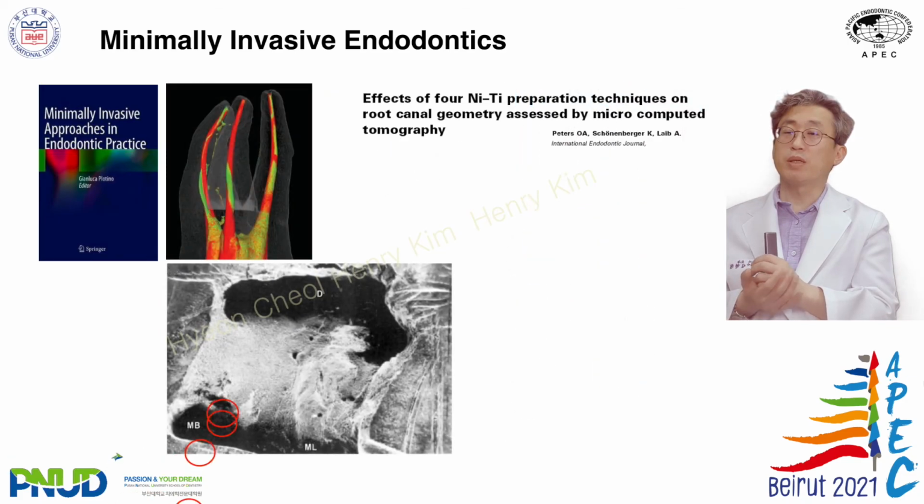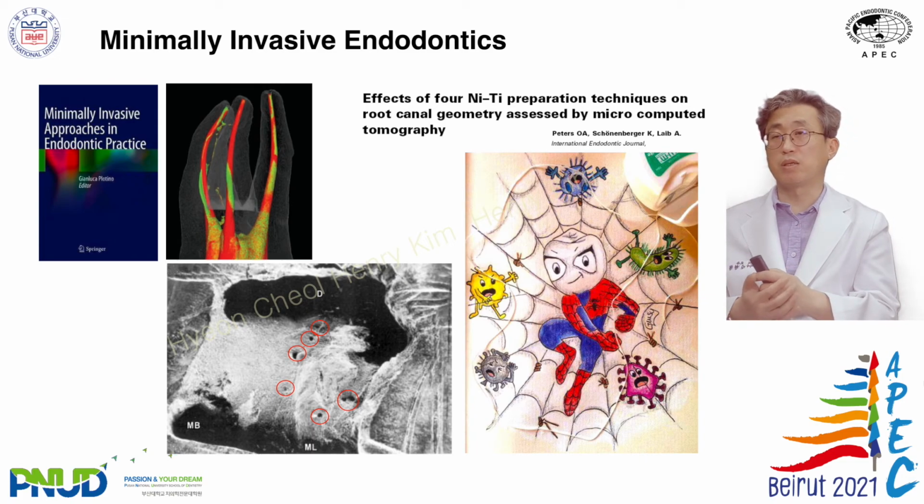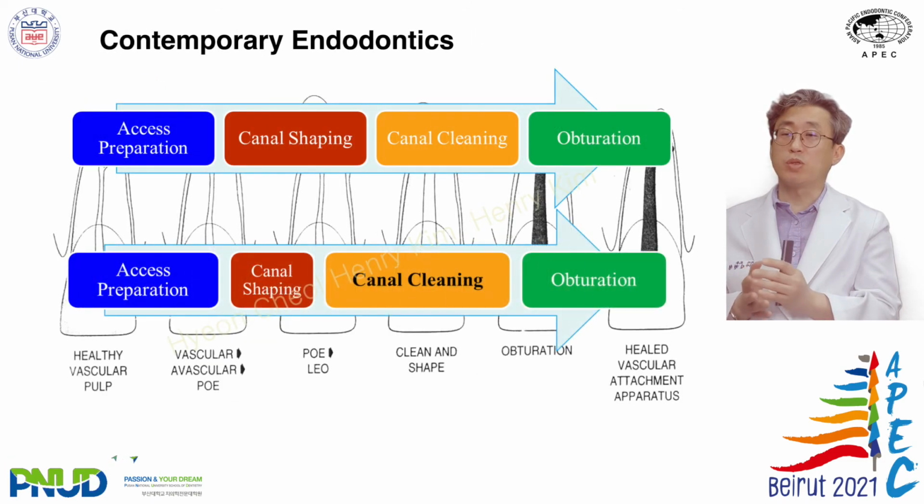But we cannot achieve perfect cleaning by using the file system only. We know the limitation of mechanical shaping. We have to focus much more on the cleaning procedure than the shaping procedure.